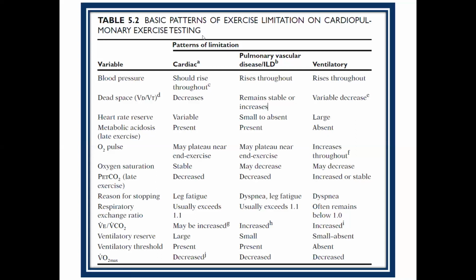Questions? Dr. Hussain, I have a question. Can you please explain one more time why in pulmonary vascular disease the VD-VT ratio remains stable or even increased?